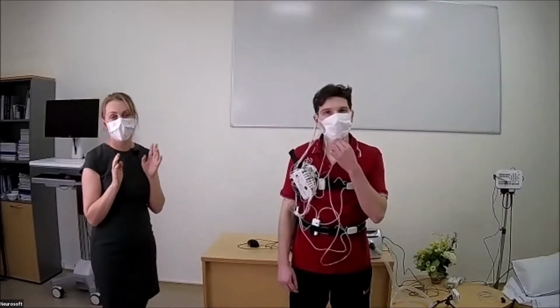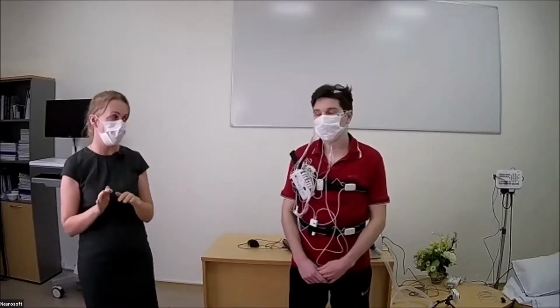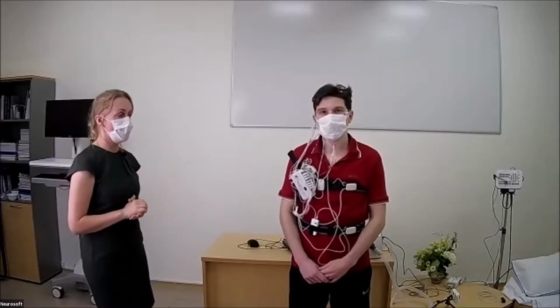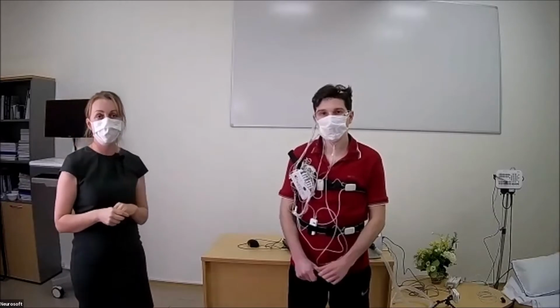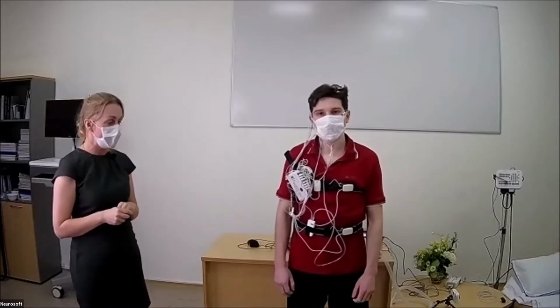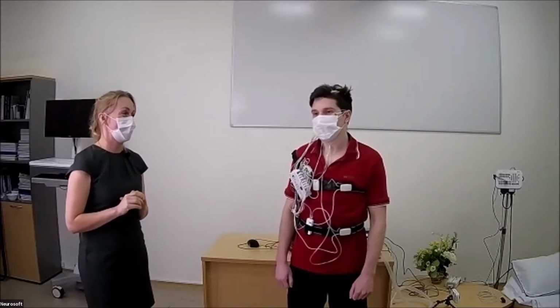So 3 different signals we need for sleep staging: electroencephalography, electrooculography, and electromyography. Now a group of channels which are very important for respiratory monitoring. And so we put on the mask.